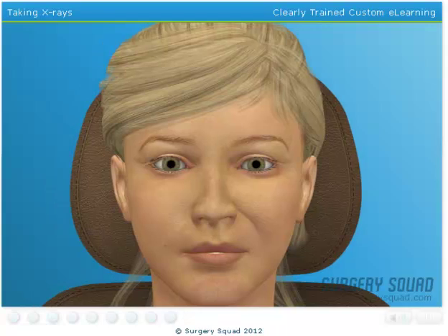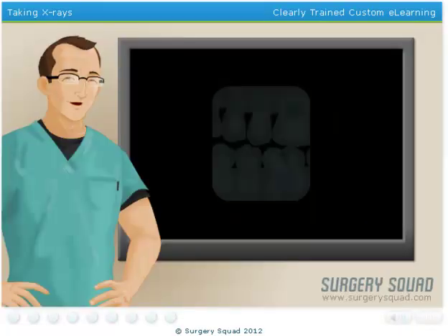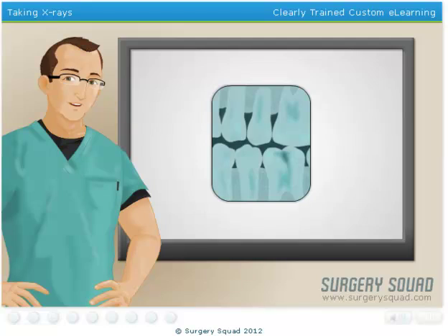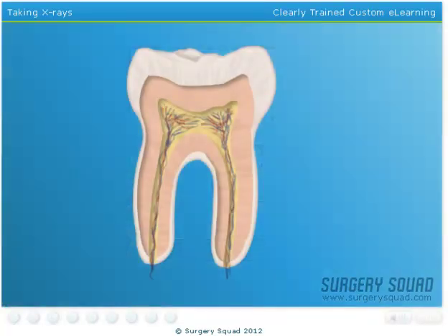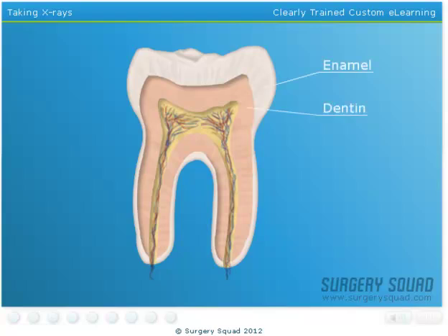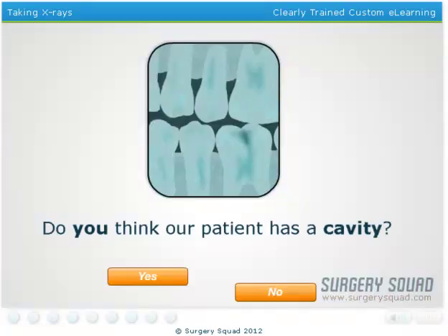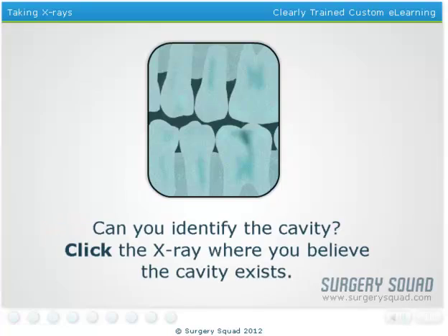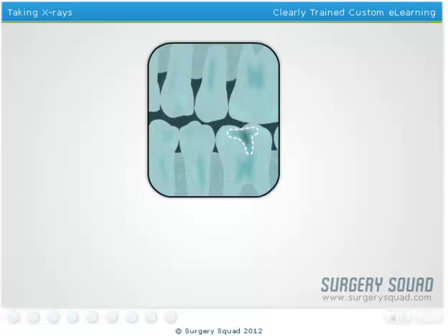I'll have my assistant handle the other x-rays, so let's move on. With all of the x-rays completed, it's time to look for potential issues. When examining dental x-rays for cavities, look for hints of changes in the density of a tooth's enamel or dentin. These locations will appear as darkened areas on an x-ray, because the decayed portion of the tooth is less intact and the x-rays can penetrate that portion. Can you identify the cavity on the x-ray? There it is — we need to get that taken care of as soon as possible.